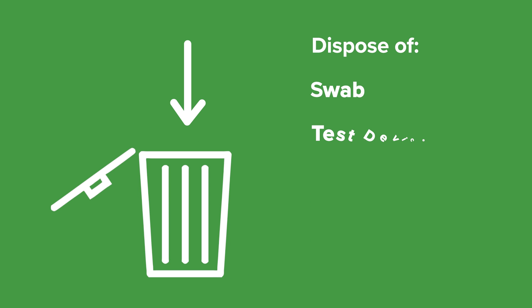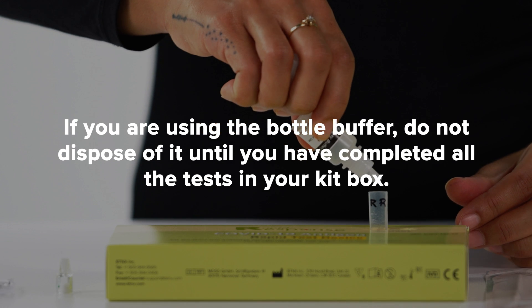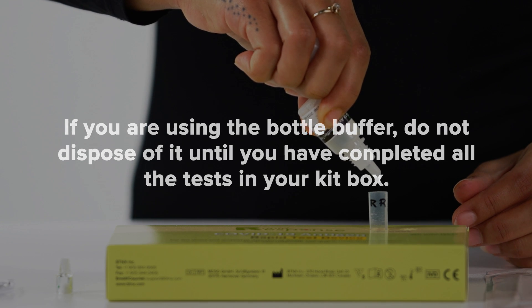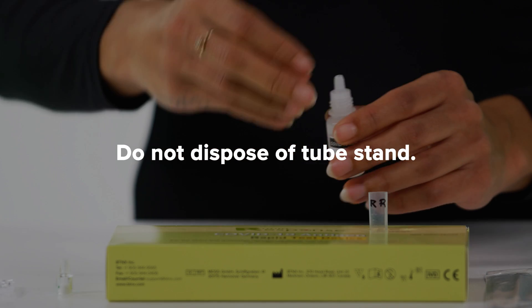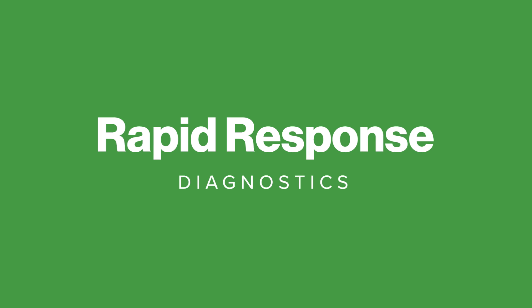Once you have read your results, dispose of the swab, test device, extraction tube and nozzle, and the single-use buffer vial. If you are using the bottle buffer, do not dispose of it until you have completed all the tests in your kit box. Do not dispose of the tube stand either, as both items can be reused for future tests. Choose rapid response.